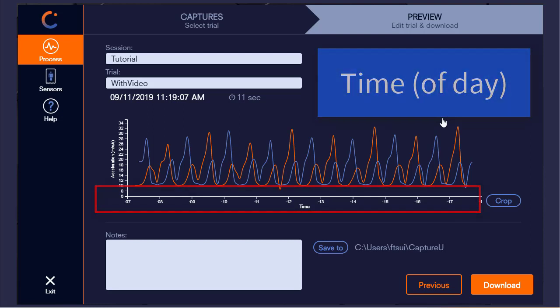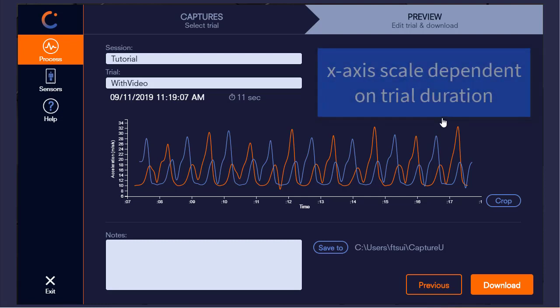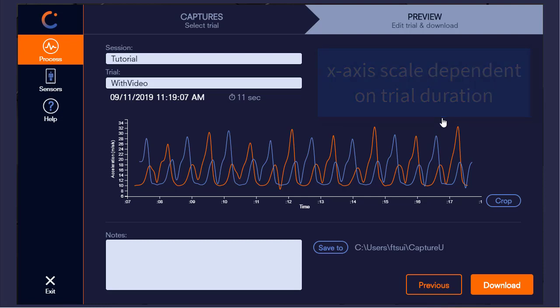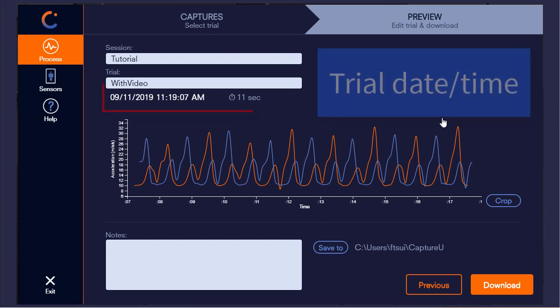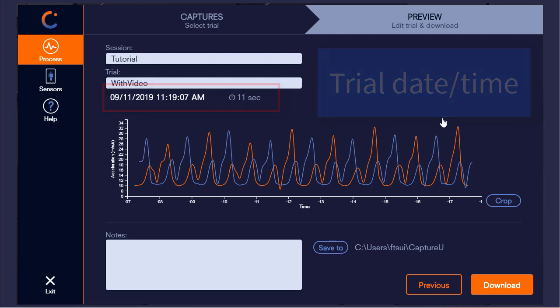Just note that this time refers to the time of day when the data was captured, and the scale is dependent on the duration of the trial. Above the graph, we can see the date and time, and since the trial was only 11 seconds long, the scale is every second.